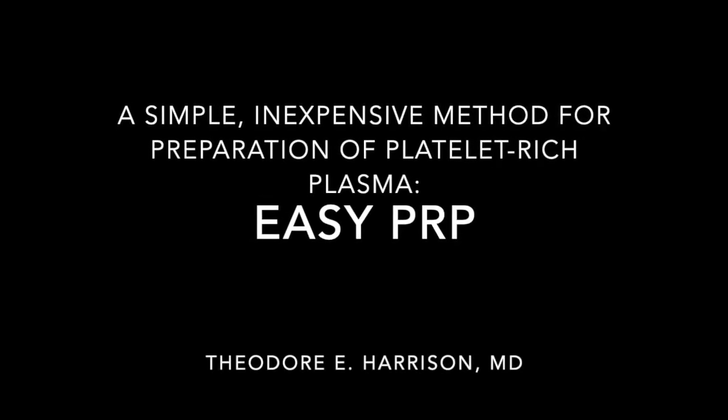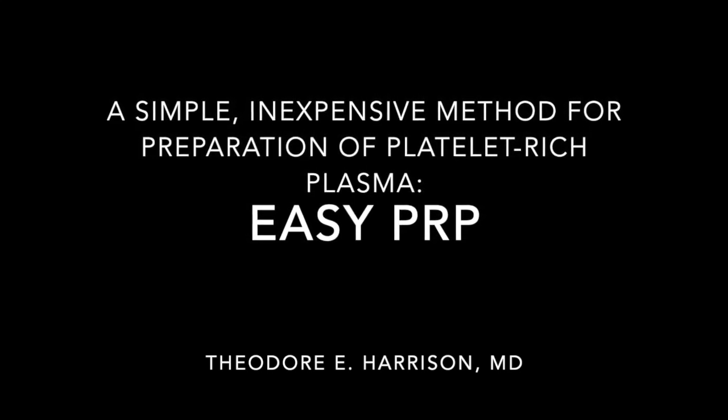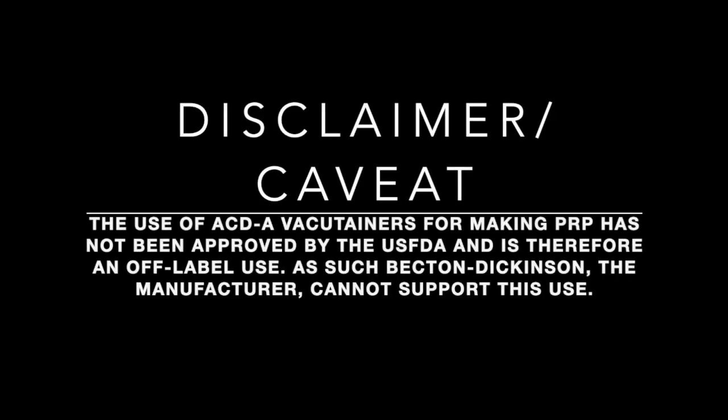Hello and welcome to Easy PRP. We're going to demonstrate a technique for making PRP that is quick and cheap. It's suitable for medical offices or clinics anywhere in the world with electricity. The vacutainer tube used in this method has not been submitted to or approved by the US FDA for this use, and therefore the manufacturer is not permitted to support its use in this method.